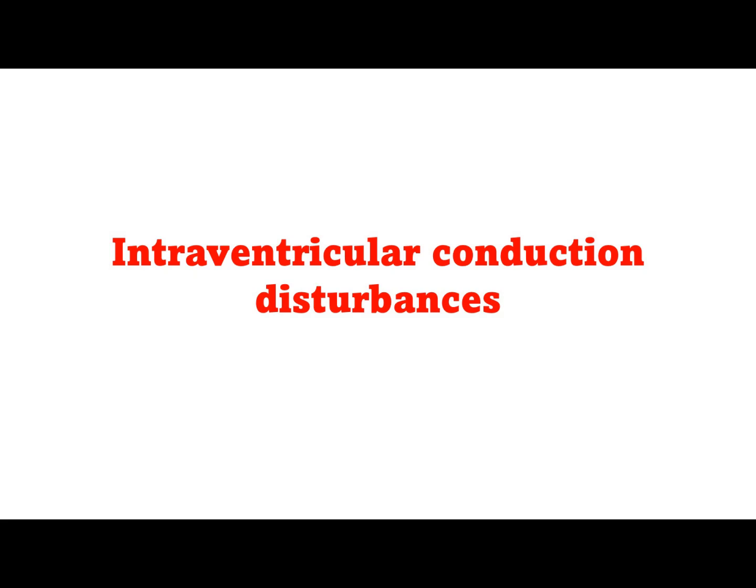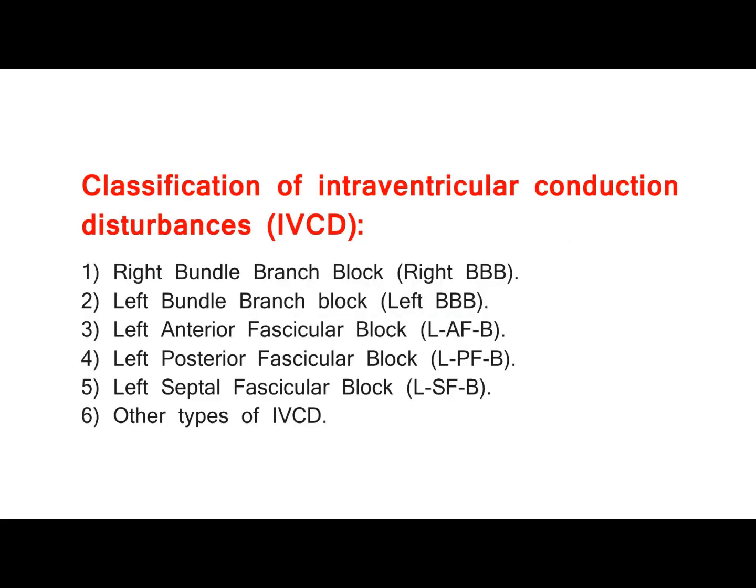Intraventricular conduction disturbances. Classification of intraventricular conduction disturbances, IVCD. 1. Right bundle branch block, right BBB. 2. Left bundle branch block, left BBB. 3. Left anterior fascicular block, LAFB. 4. Left posterior fascicular block, LPFB. 5. Left septal fascicular block, LSFB. 6. Other types of IVCD.